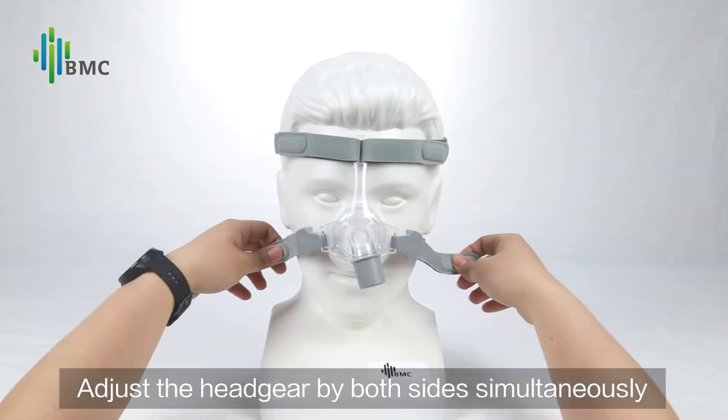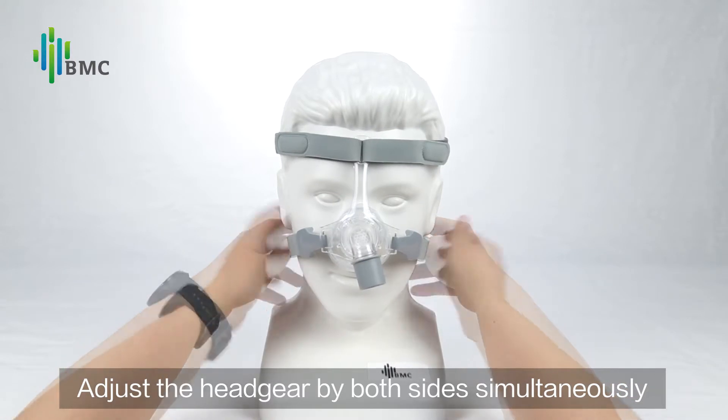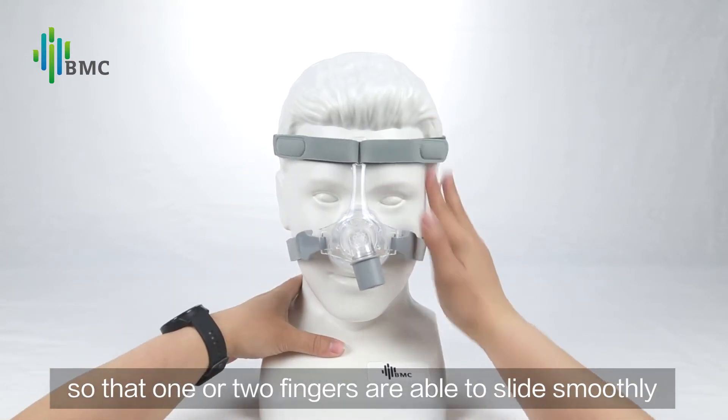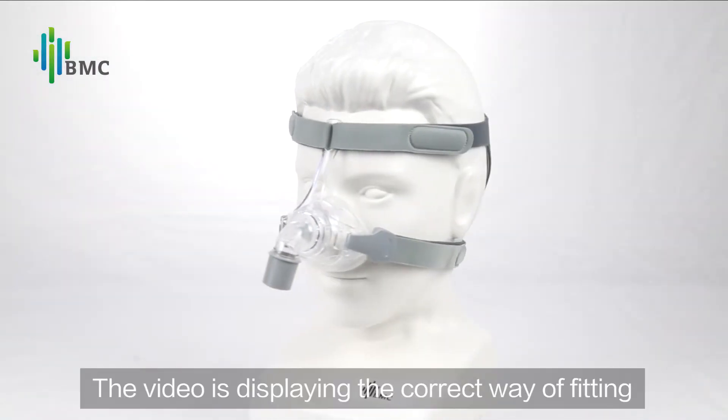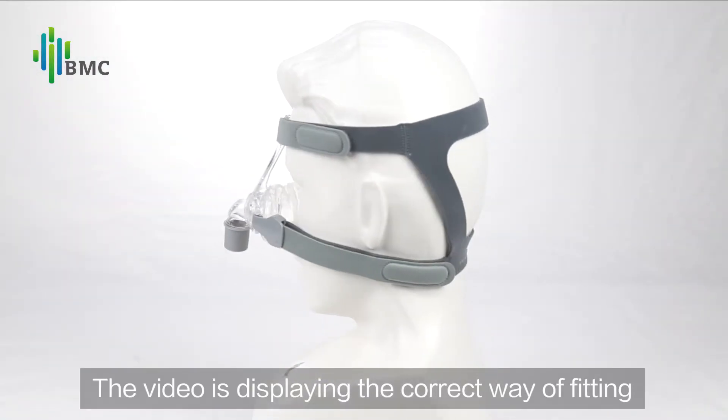Adjust the headgear on both sides simultaneously so that one or two fingers are able to slide smoothly. The video is displaying the correct way of fitting.